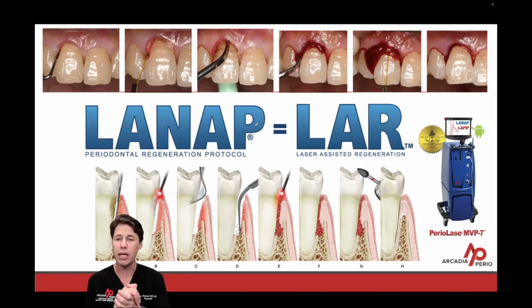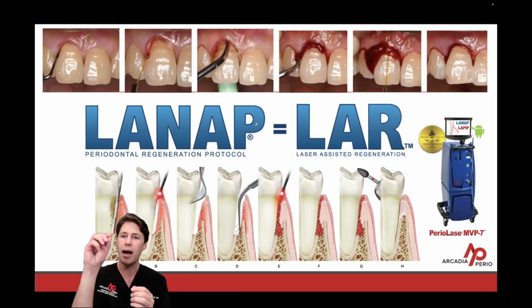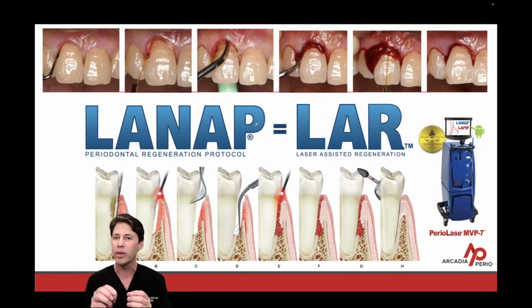So if my pulse durations are super short, my peak powers are really high. So the amount of power per pulse delivered at 100 microseconds is about 1800 watts. At 150 microseconds, it's about 1300 watts. And it goes down proportionally after that.